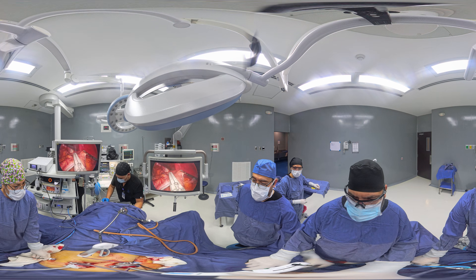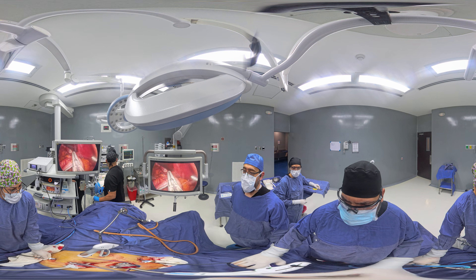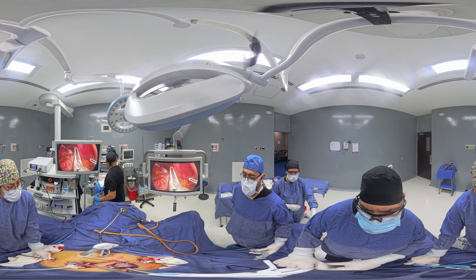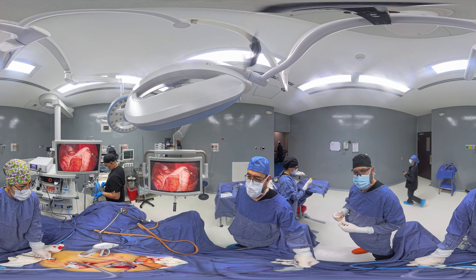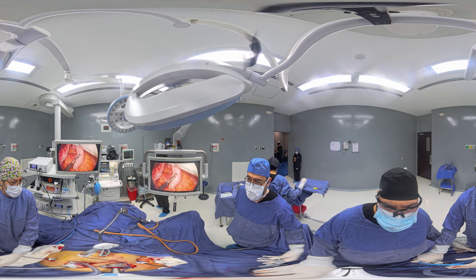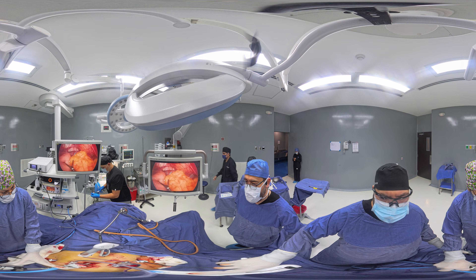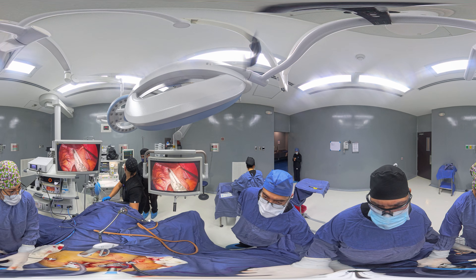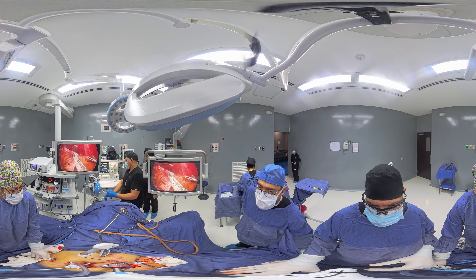Remove the bougie — make sure we're not compressing it with the stapler. As we work ourselves through, this is the third load, the third stapler cartridge. Again, create a little bit of compression just for a few seconds.